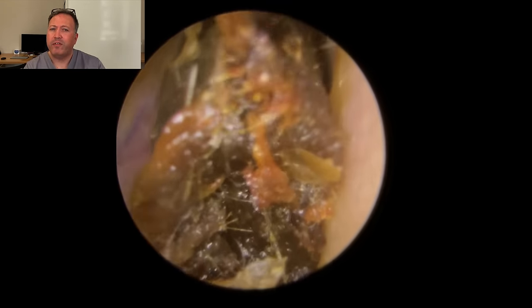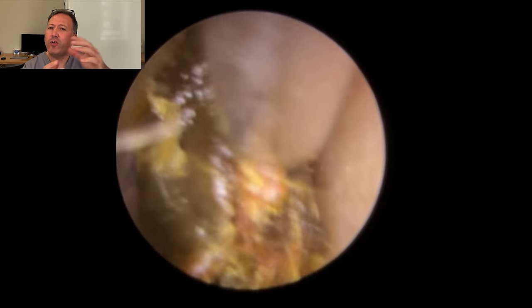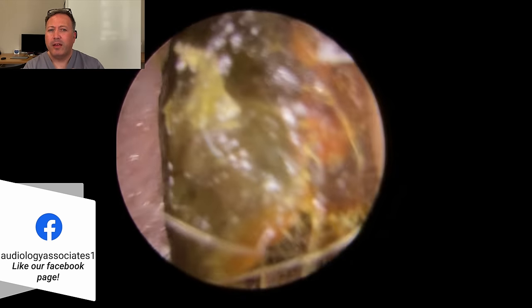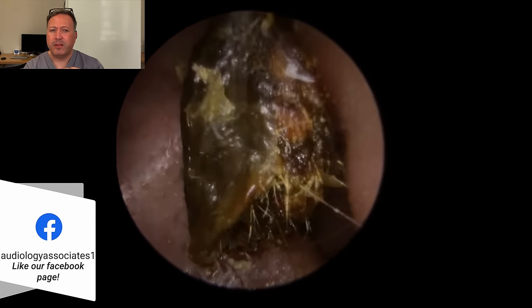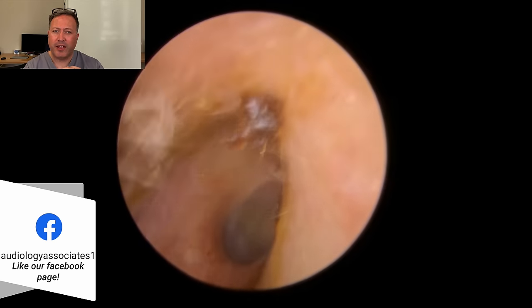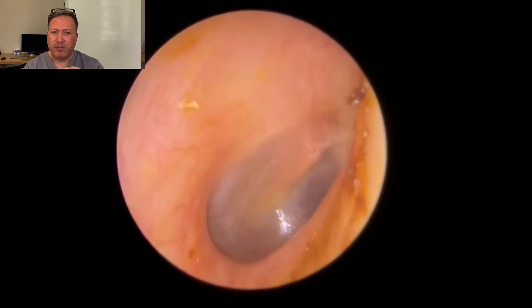What we can do then, if you've got a particularly hard section of wax, when you fold it, the section behind and the side sections tend to be a little bit softer, so it enables you to get a better grip. There we are. Nice big plug of wax come away there. If we take a look behind that then, we can see we've got it all out there.